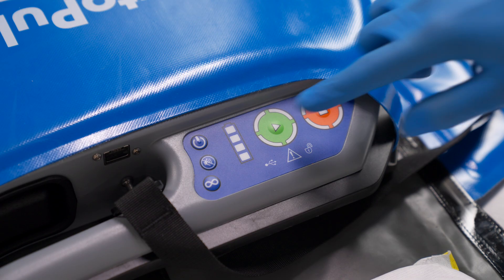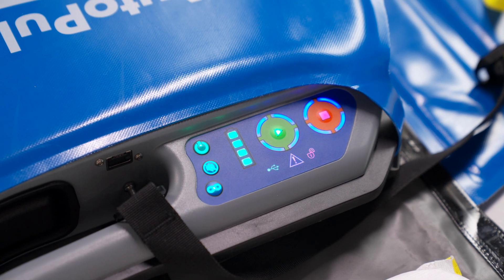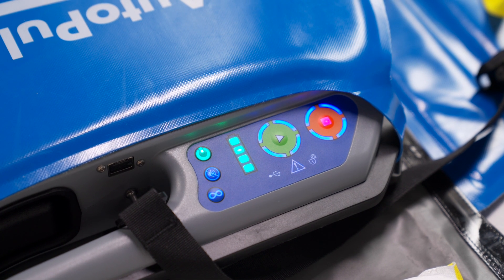Fully extend the black and yellow straps of the shoulder restraint above and off the top of the platform. Power the AutoPulse NXT on by pressing the power button on the user control panel. The power button will illuminate green.